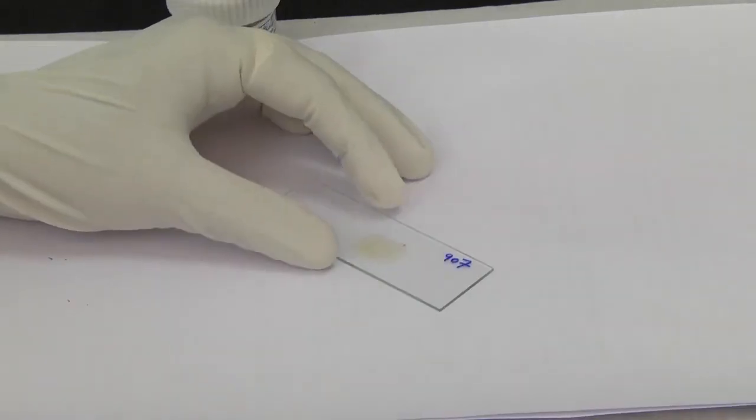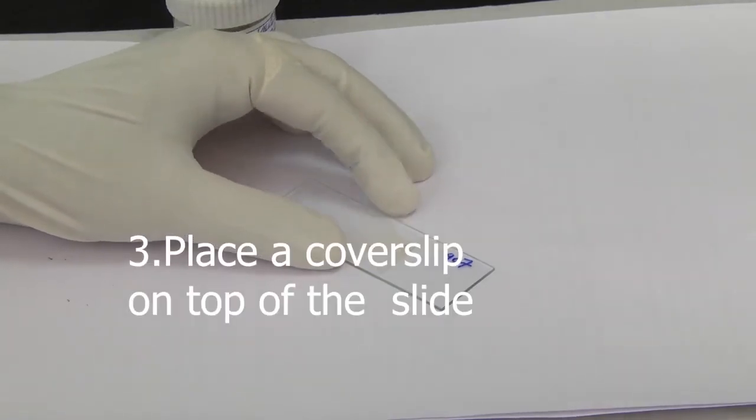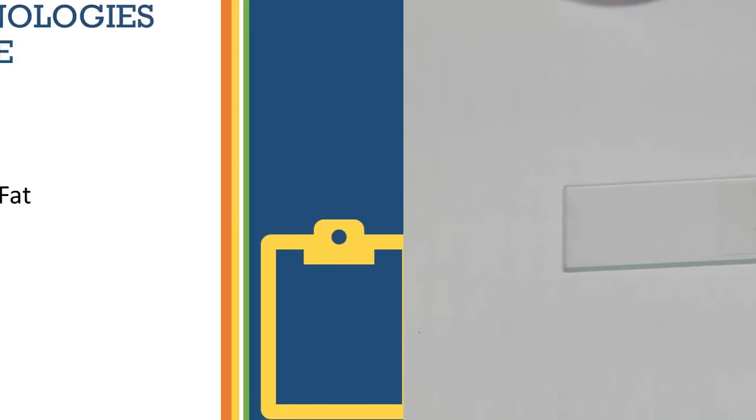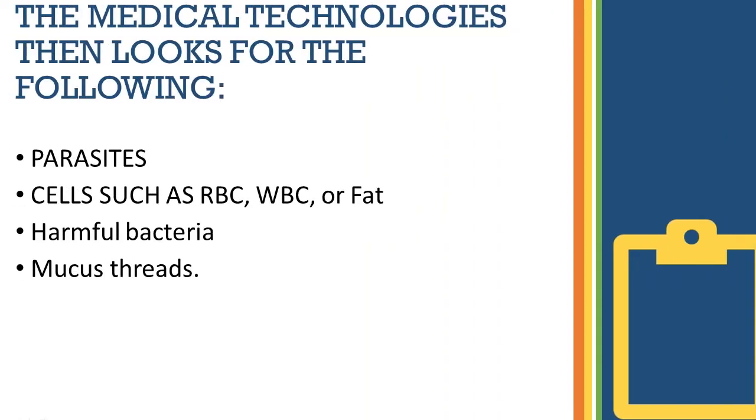Place a cover slip on top of the slide and examine immediately using the microscope. The medical technologist then looks for the following: parasites, cells such as RBC, WBC, or fat, harmful bacteria, and mucus threads.